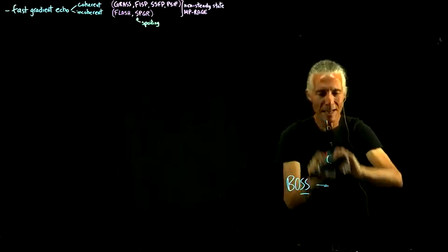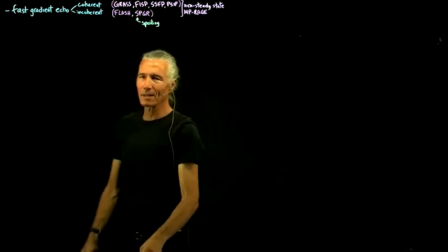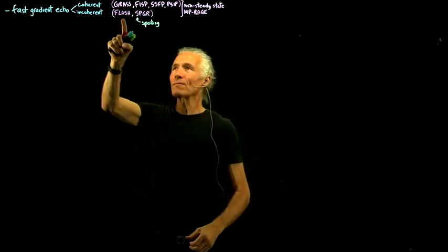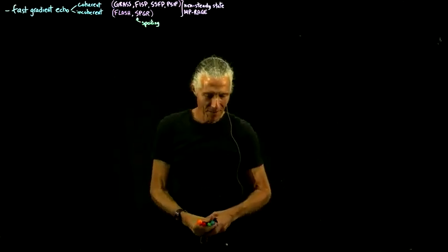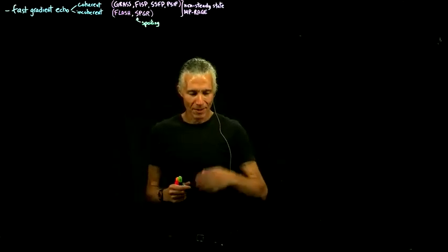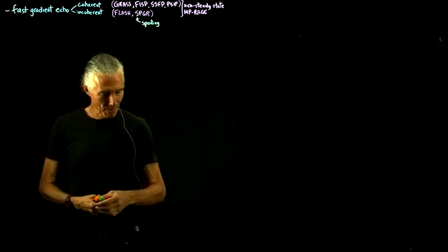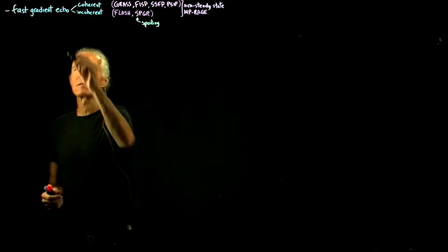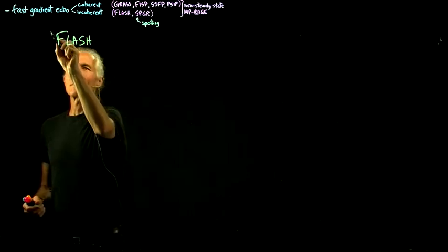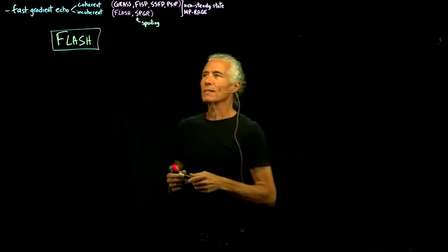Okay, so now one of the most common sequences, because every single localizer, when you first stick somebody in the magnet, the first thing you do is a quick and dirty localizer to find out where their head is. That's going to be one of these FLASH spoiled grass. And so how does the spoiled grass work? So I'll do a 3D example of that. This one is called FLASH. That's probably the most common word that people use for this. So what is it?